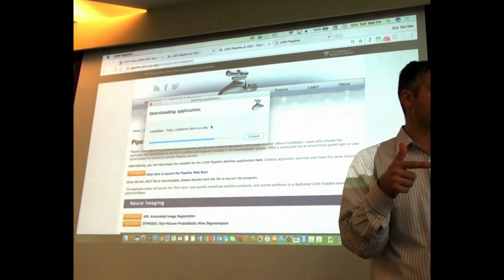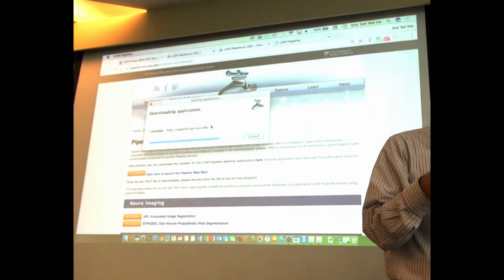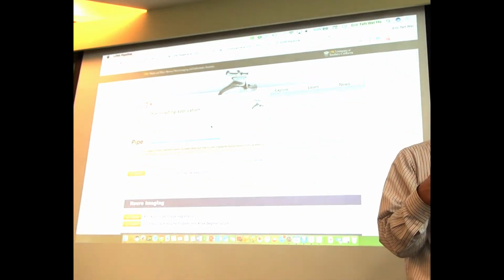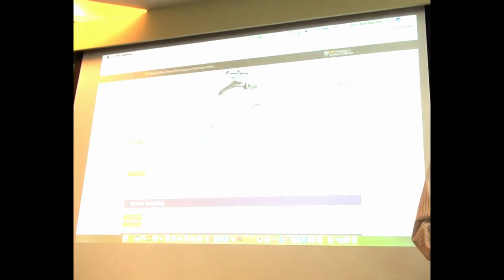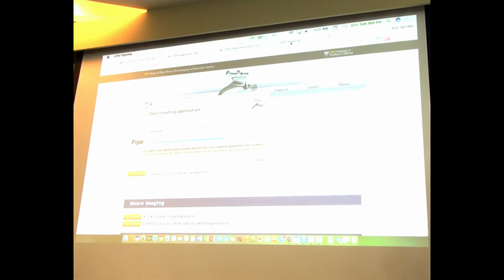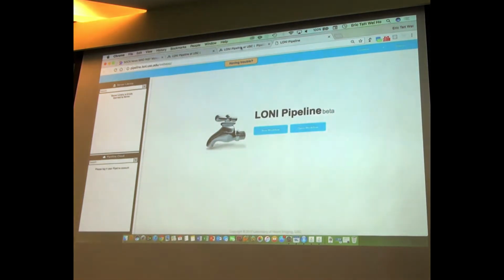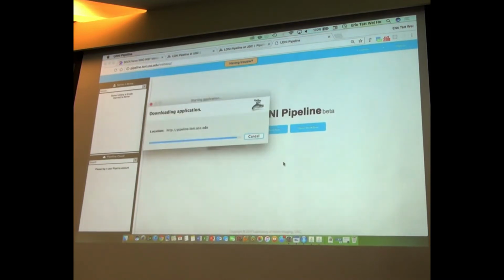But once it finishes downloading, it should be able to start the client. And then, while we wait, is the web app? Okay, so this is loaded. We will try to use the web app in a second. Okay, so what happened now? Is it here?